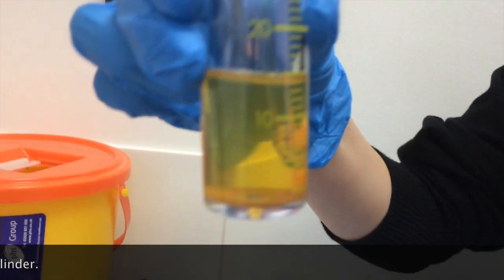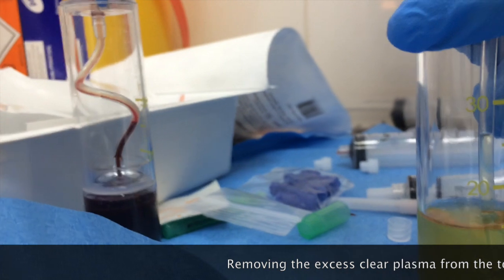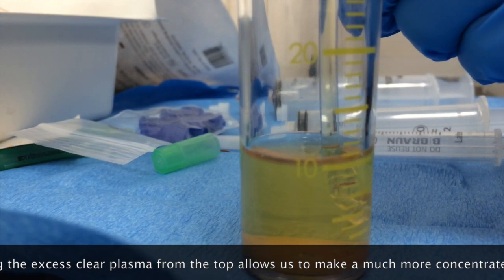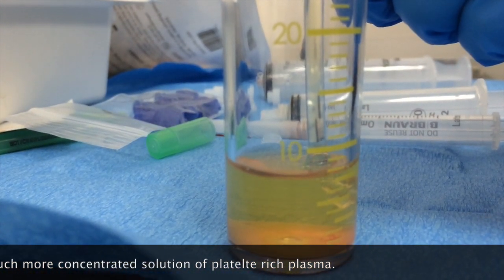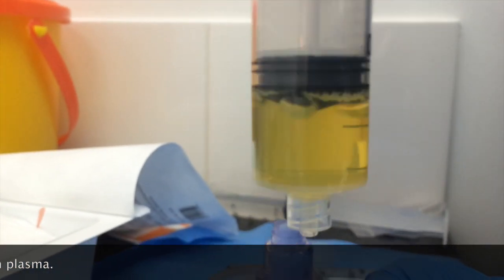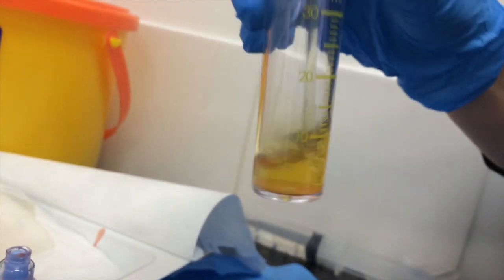So here we have — see how much clearer it is? Because all the platelets and the red cells have settled to the bottom. So now what we're going to do is remove the plasma. Take about two more cc's out of there. That's the extra plasma you remove. And this is the plasma we're going to use to suspend — so we're going to go back and forth a little bit, adding in the PRP with a swirling action.